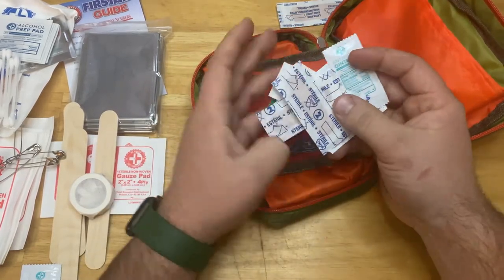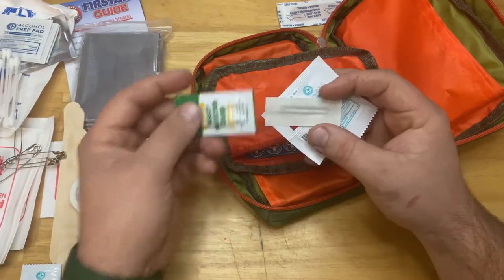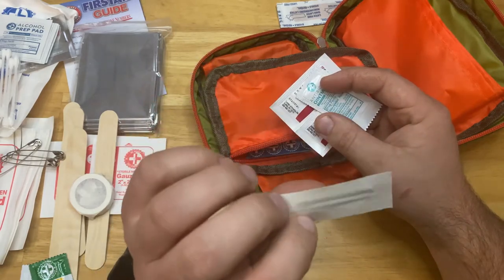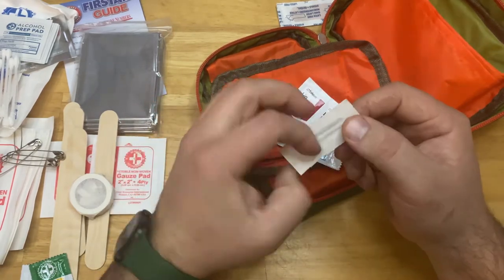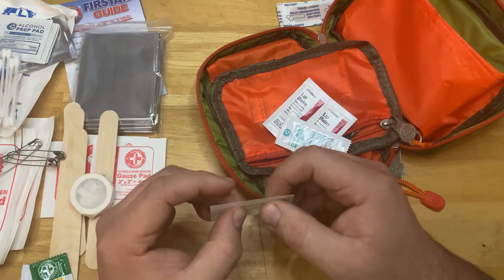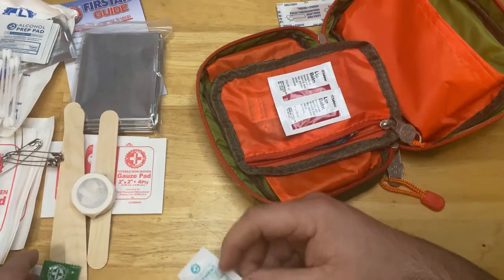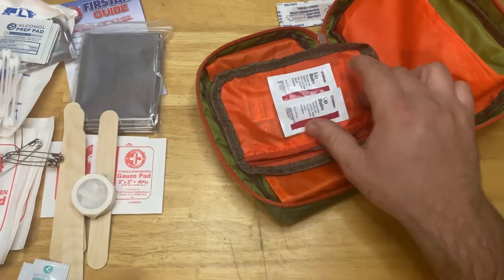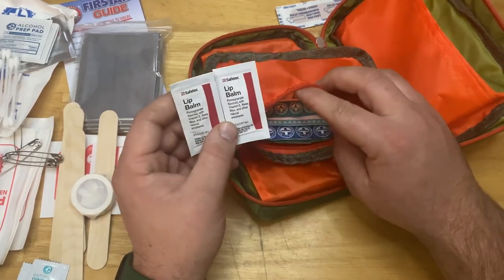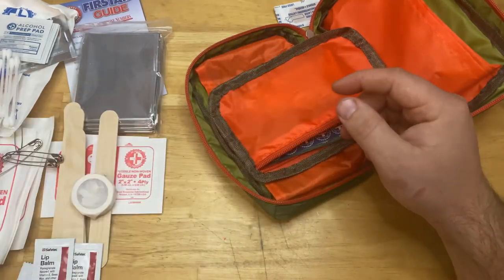There are some small bandages, more insect protection cream, and a splinter remover — it's got a little pin that you can use to dig out a splinter. Another triple antibiotic ointment, a lip balm for chapped lips, and another first aid and burn cream.